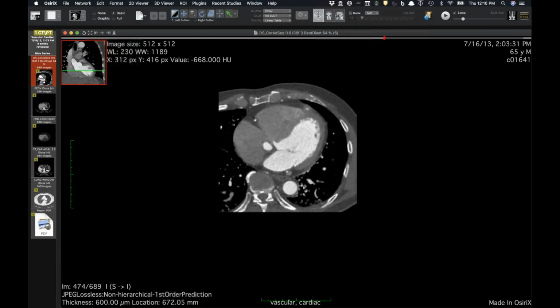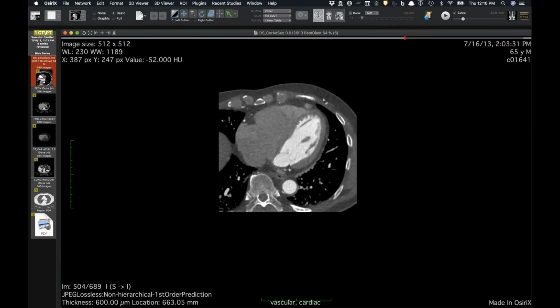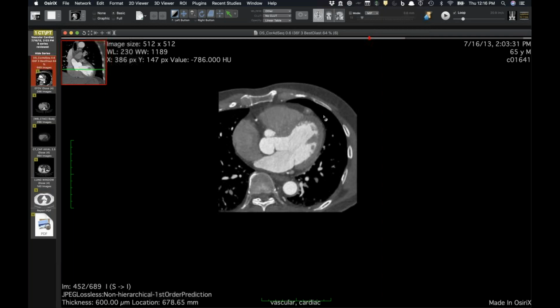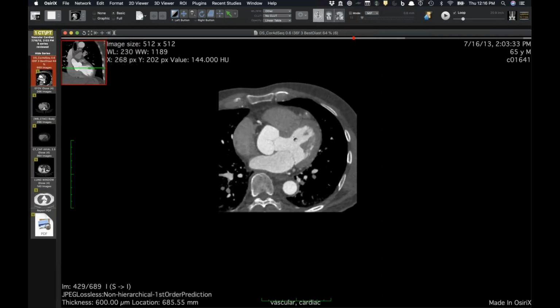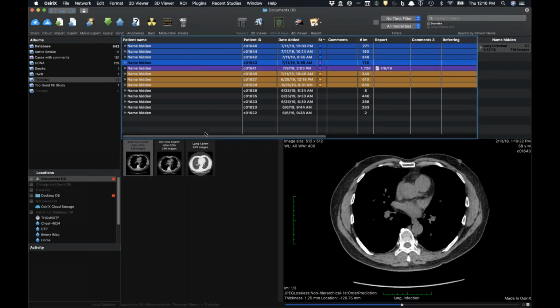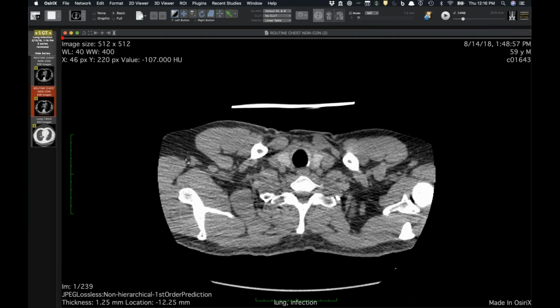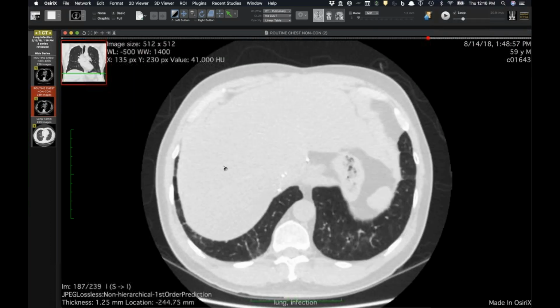But that's what it's being treated as presumptively, just of a small to medium sized vessel instead of the aorta. So that is remarkable. I'll show one more here, and then I will stop for now.